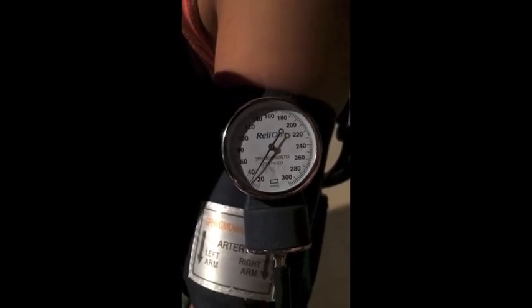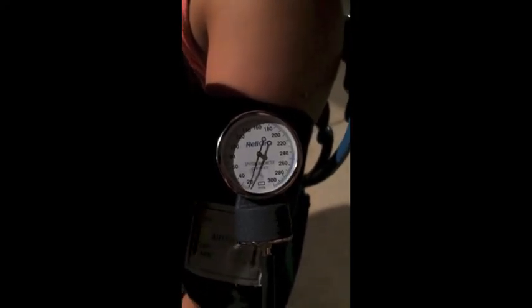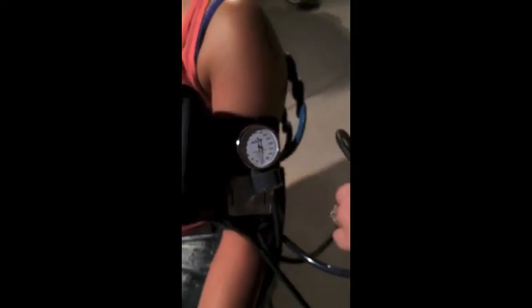Continue to slowly deflate the cuff and listen closely until the sound of the heartbeat disappears. As soon as you can no longer hear your subject's pulse, note the reading on the gauge. This is your diastolic pressure, which is the pressure between heartbeats. Allow the cuff to deflate completely and record the blood pressure.